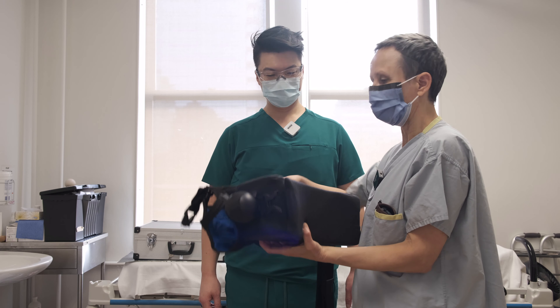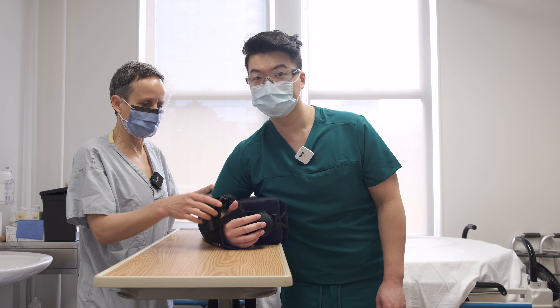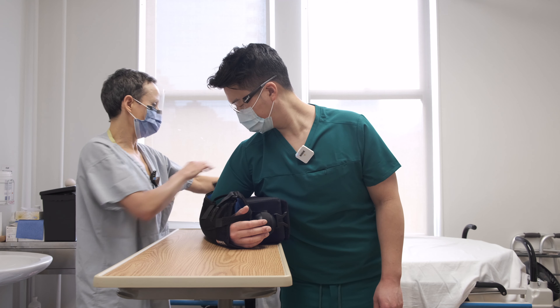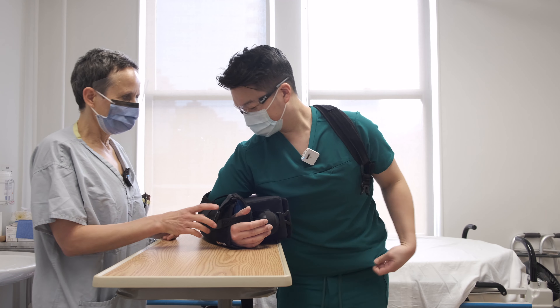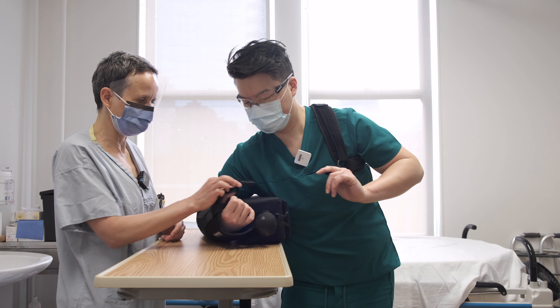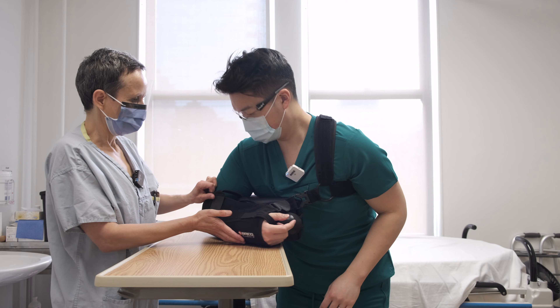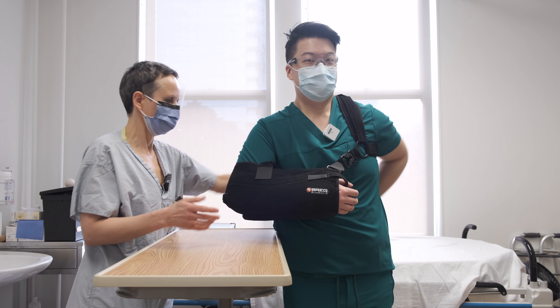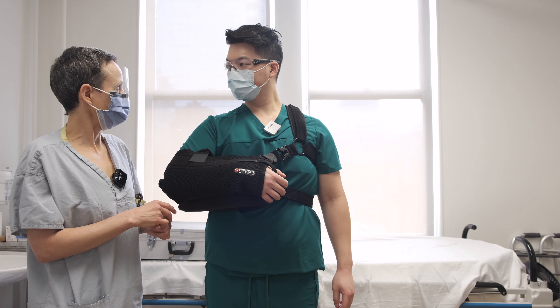To put it back on when you're alone, put the sling on a table or sit down so it's resting on your legs. First, you're going to slide your arm into the sling — remember, you want your elbow all the way to the back. There's a little anchor so your hand can slide around. Then, on the other side, remember like a backpack — that's the tricky part, getting it to the other side — just like a backpack. Find the right clip; it only goes into one clip. Then find your belly strap in the back and clip it in — that's all you have to do.